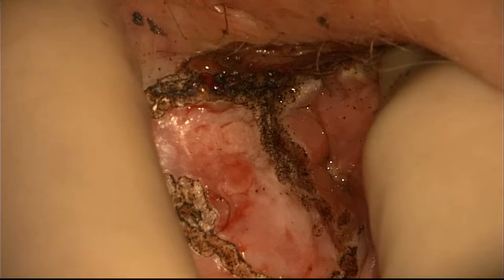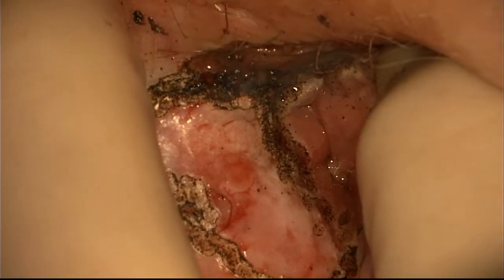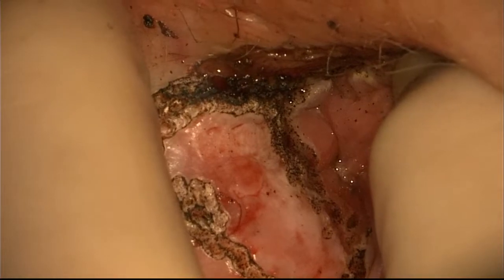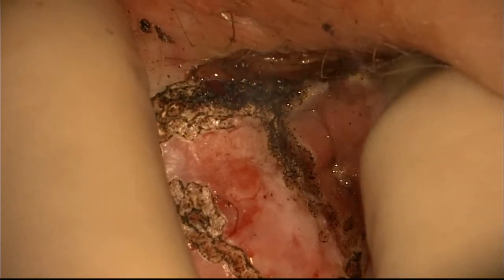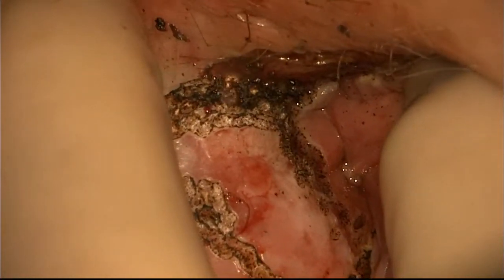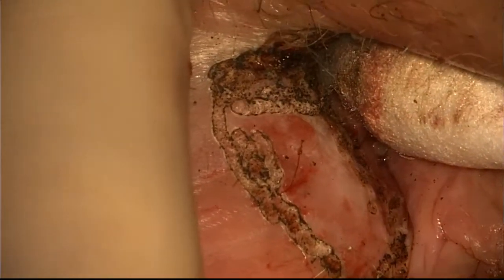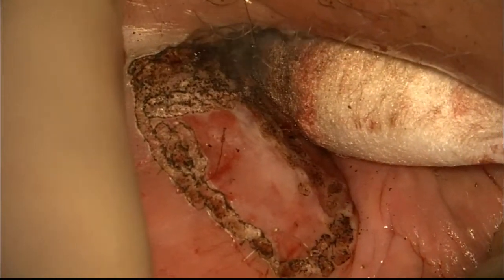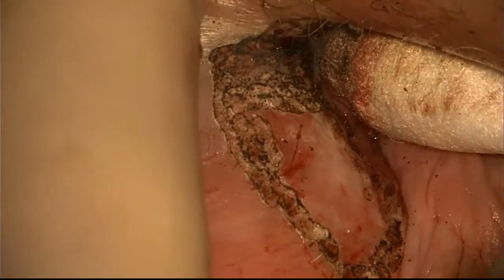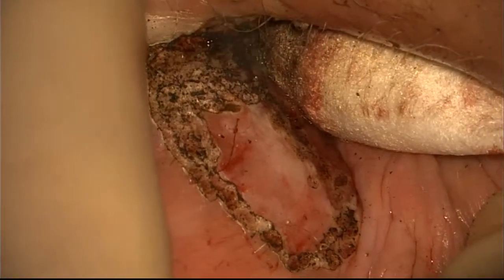Here I am using the toggle on the laser head to move the laser beam. Now I am moving the patient's tissue and not moving the laser toggle.